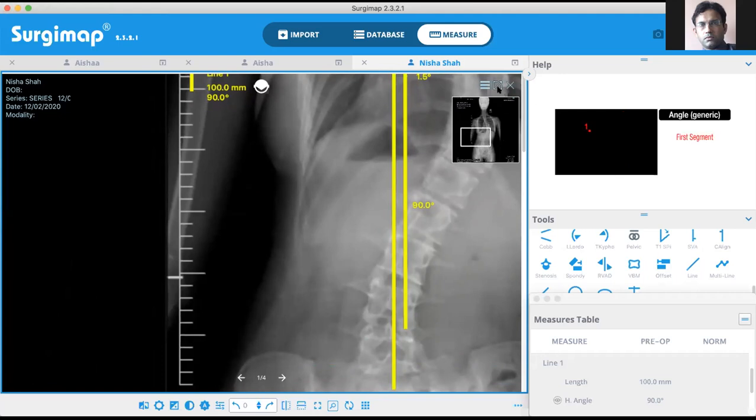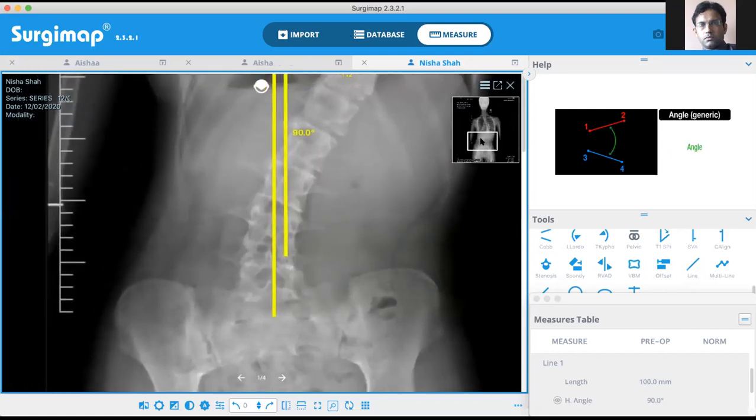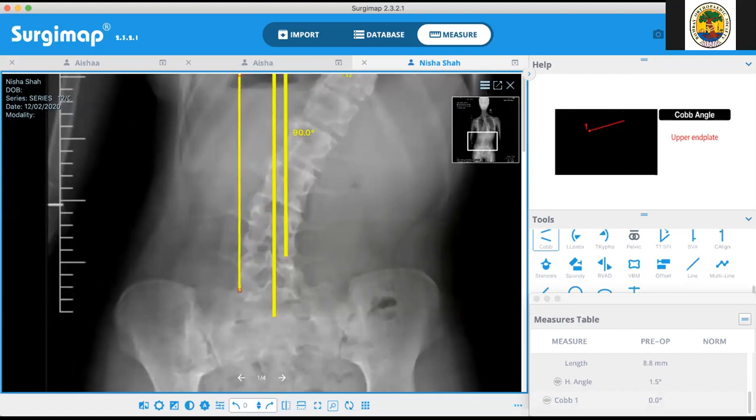Stable vertebra. To some extent we can judge by looking at the central sacral vertical line. Otherwise, the right method to check the stable vertebra is to make two lines parallel to each other, starting from the L5-S1 joint, and I make this vertical line here, almost parallel to this one. By SRS definition, it's the one most closely bisected by the central sacral vertical line.